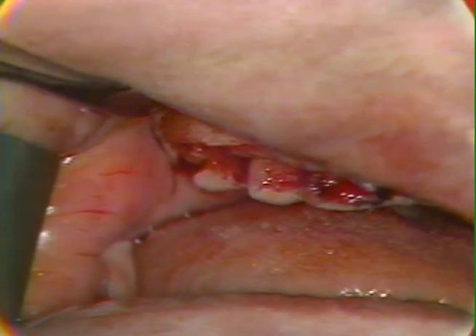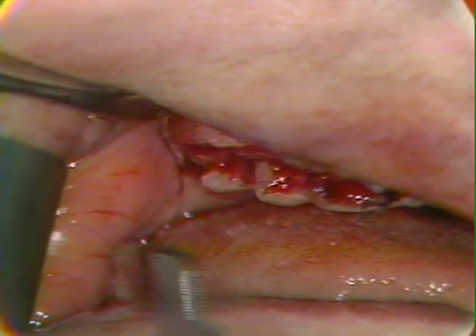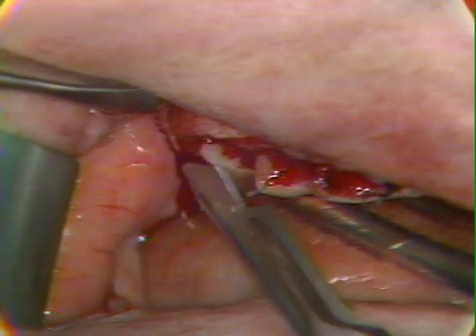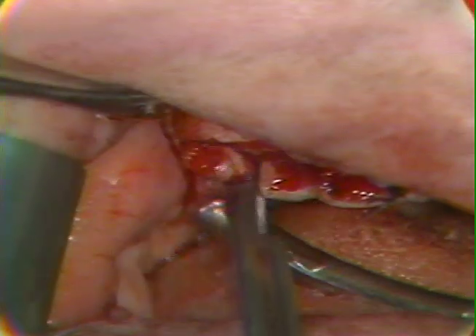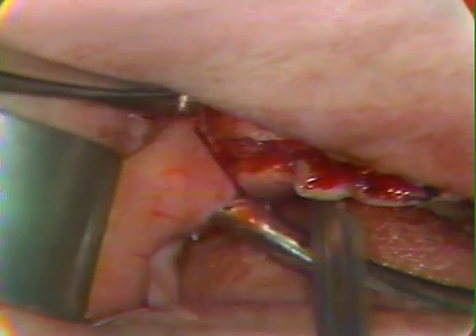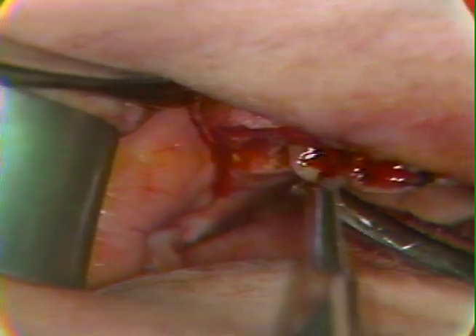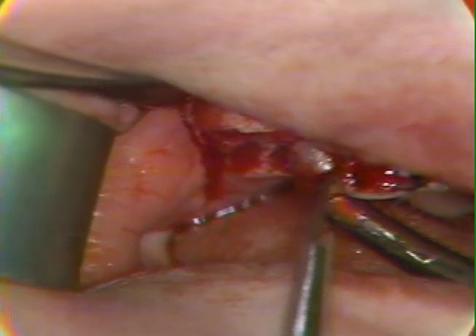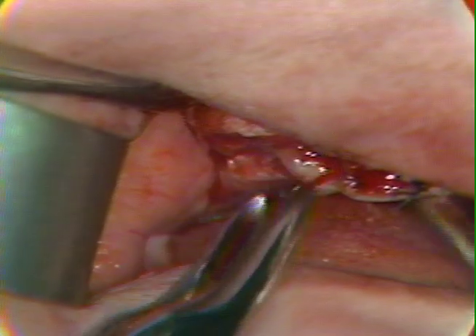I'll take the 15 blade first, and as we did with the other mandibular isolated molar, we'll take a wedge section out of these redundancies on the distal and also on the mesial. And then we can retrieve that tissue with the small rongeurs, which will help to grasp it and control it.